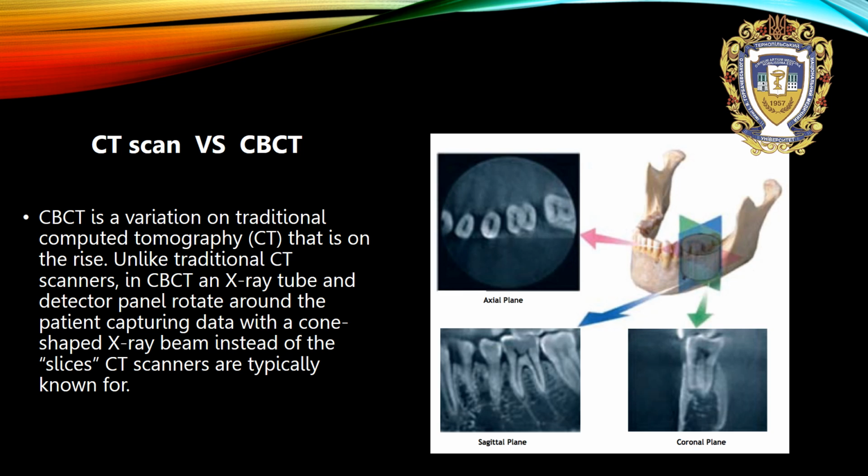But nowadays in medicine CBCT, cone beam CT, is present. What are the differences between CT scan and cone beam CT, and advantages?